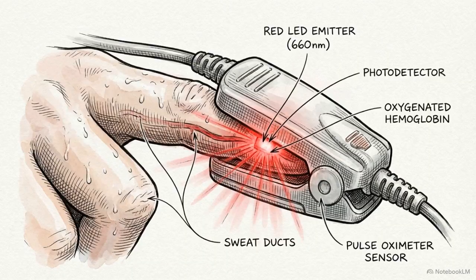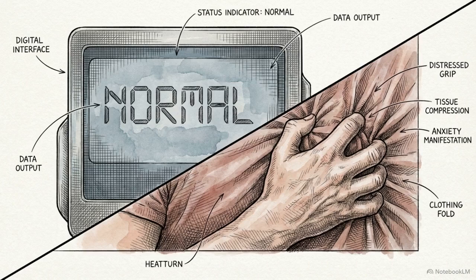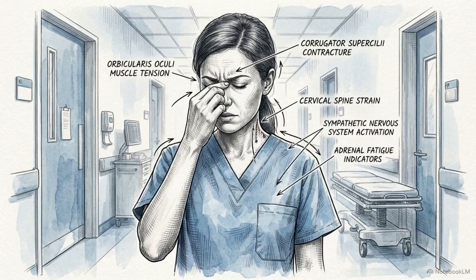But when the medics place the pulse oximeter on his finger, the monitor displays a perfect, reassuring oxygen saturation, 99% on room air. A perfectly normal reading on a suffocating patient is a massive red flag. The data on the screen violently contradicts the physical reality in the bed. That 99% reading is a dangerous mathematical artifact baked into the optical engineering of the monitoring machine itself. This specific vulnerability catches even experienced clinicians off guard.